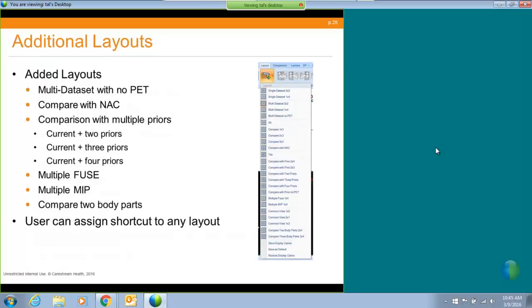It's configured in a different place in the central configuration, but the current paradigm we are going with is that we will change whatever layout users are asking. We implement it to the central CFG, and next version will come with it.